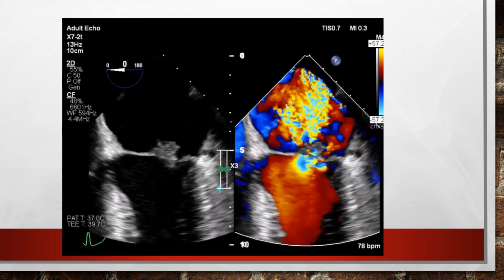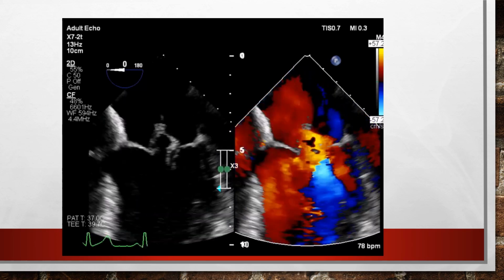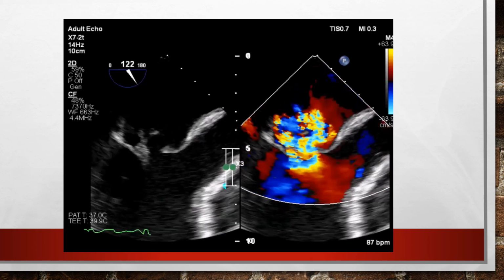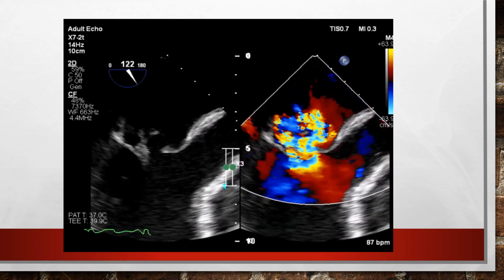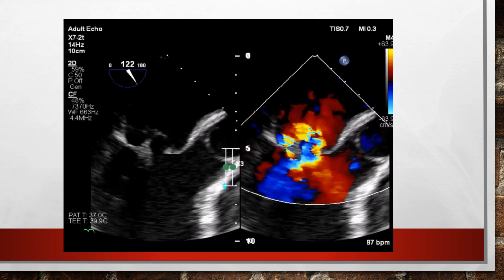you can see clearly there is perforation within that cavitation within the mitral valve, an aneurysmal mitral valve leaflet. Again, the same finding. This is 120 degrees and this is the anterior mitral leaflet, and clearly you can see that windsock deformation of the anterior mitral leaflet, an aneurysmal mitral leaflet with perforation.